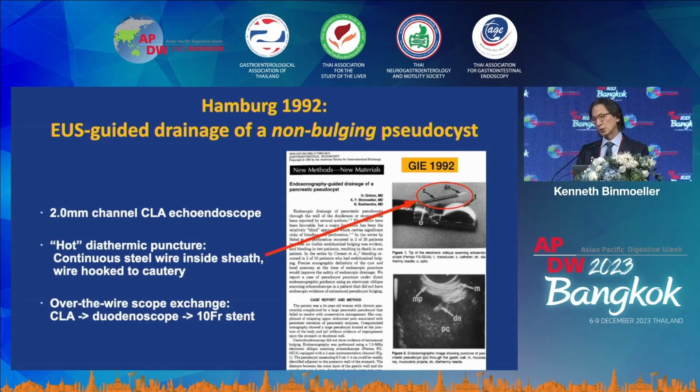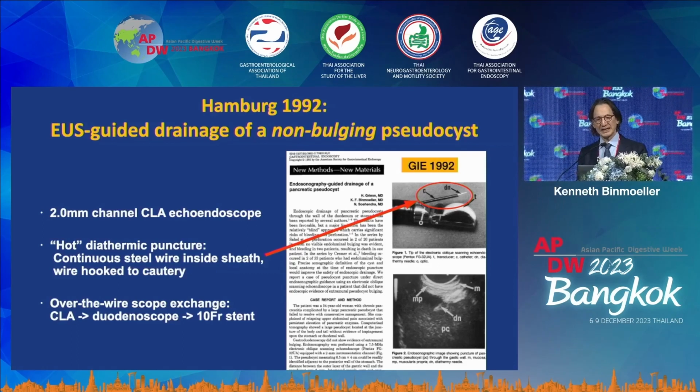So we were draining pseudocysts, but a requirement was that they be bulging with a prominent bulge for endoscopic guided drainage. And Pentax had just delivered a prototype curved linear array echoendoscope, and we were doing our very first fine needle aspirations with that scope. But it was Nib Sahendra who thought about the possibility of self-fashioning a needle that would allow us, with diathermy, to enter into the pseudocyst under EUS guidance.